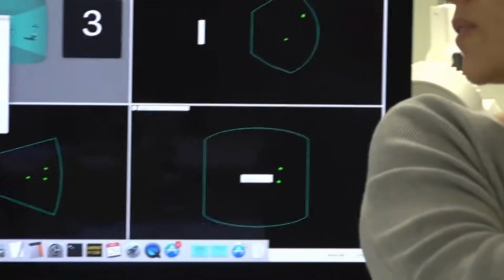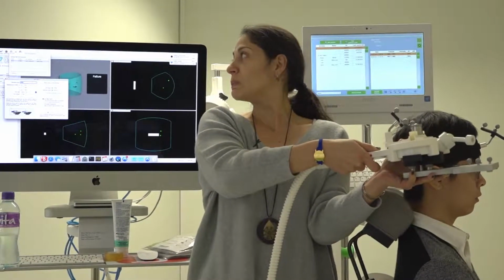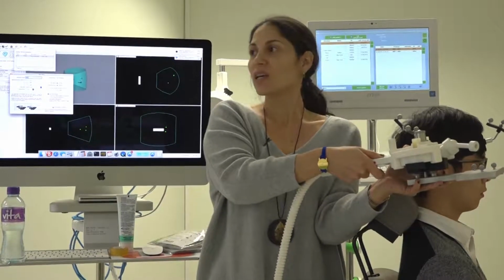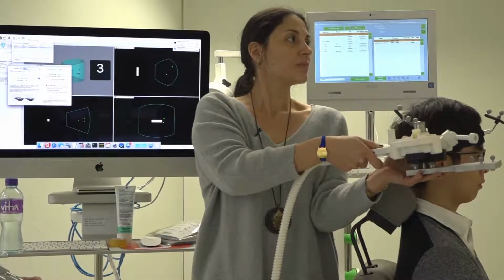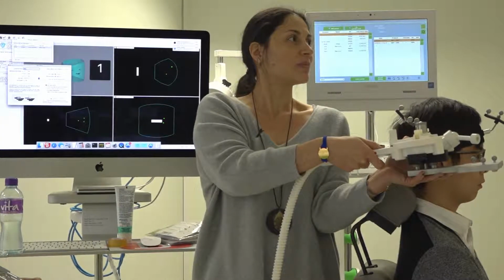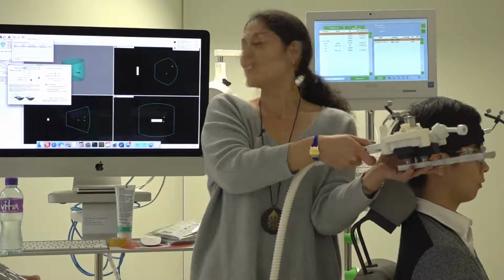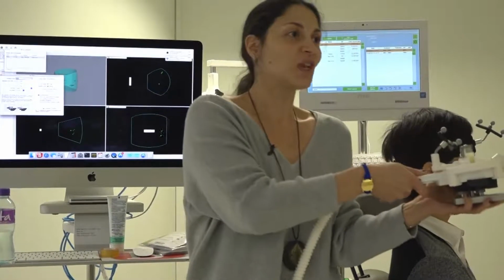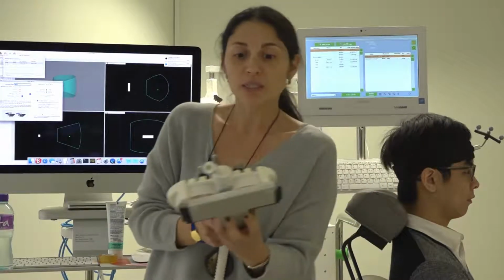So you wait. 3, 2, 1, and no move. Failure. I moved. You shouldn't move in the last second. Can you click again, please? Success? Yes. So I didn't breathe. Don't breathe. In the last second you need to keep still, then it will go. Now you have the coil calibrated.